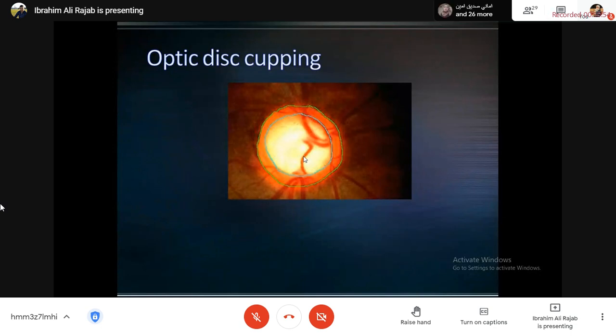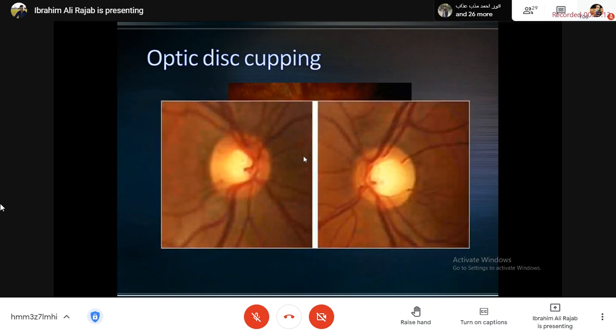يعني لاحظت آلاء فلاح أن الكاب هذا اللي هو محاط بالأزرق، more whitish in color، تقريبا أكثر من النص. فهي قالت 70 إلى 80%، وكلامها صحيح. فراح تكملي معنا آلاء. تشوفين آلاء الديسك اللي على ايدك اليسار، الكب مالته اللي هو سنترالي، مهم انت راح تقولي لي تقريبا إيش قد محتل من الديسك، يعني برأيك.